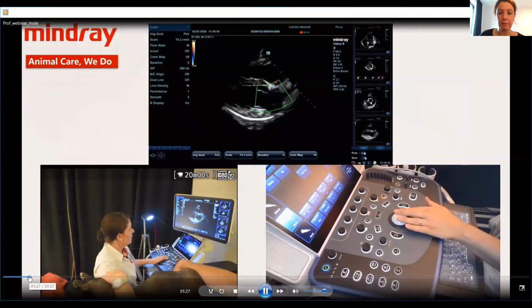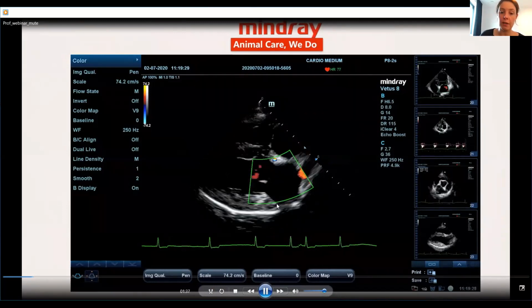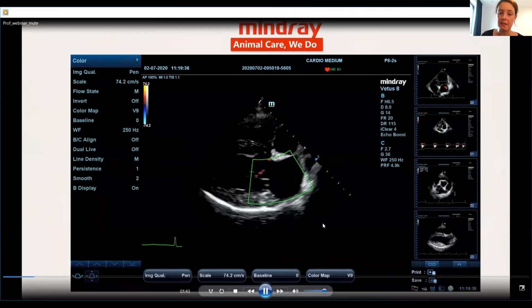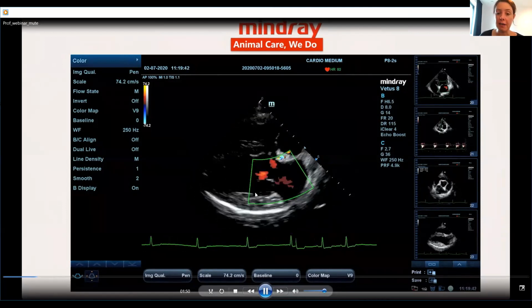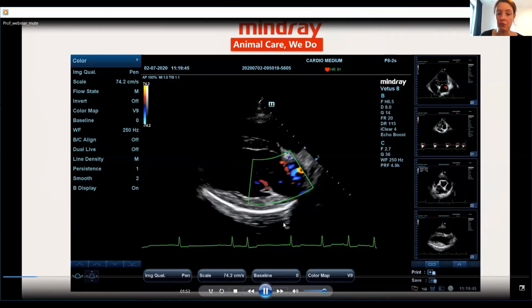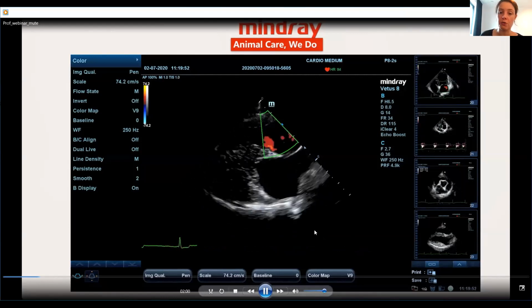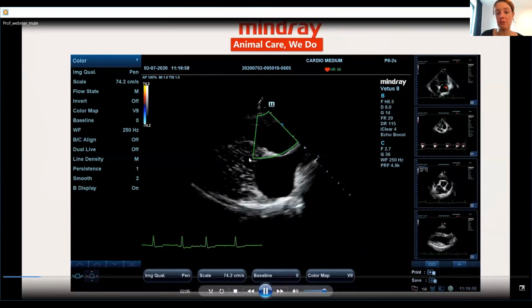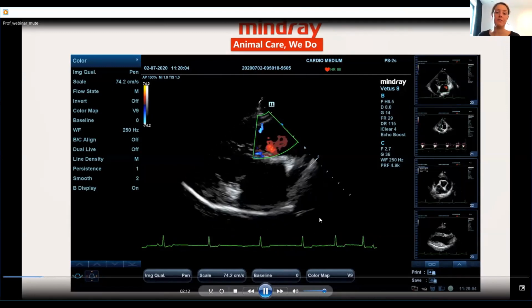Then what you can do in this image is assess the cardiac valves using color Doppler. I have to say, Doppler, as I said, always works best when you are parallel to the blood flow, and this is less so for color Doppler than for pulse wave and continuous wave Doppler. You see, I am scanning from here, so I am perpendicular to the bloodstream, and you will see color Doppler. But it helps to also have a look at the valves from the left apical view, because sometimes there will be small insufficiencies that you don't see in this view, and then you can check again on the left apical view.